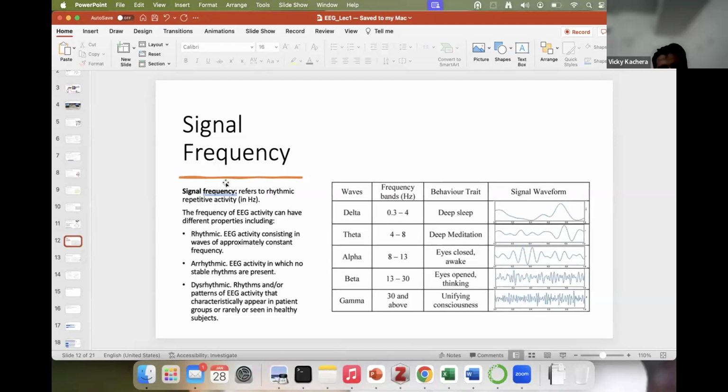Yes. So when you plot it, from here to here, you had hundreds of samples. Then you plotted the signal versus time, and I'm seeing a peak here and a peak here. So it's two peaks. Out of the 100 samples that I had taken, I'm seeing two peaks only. So my frequency is 2.